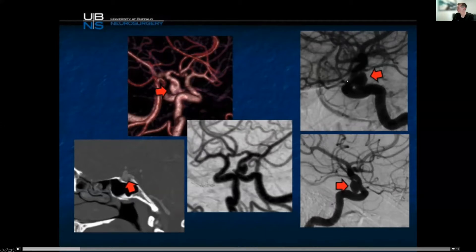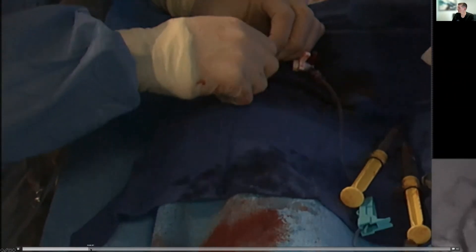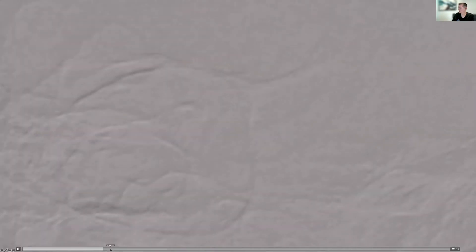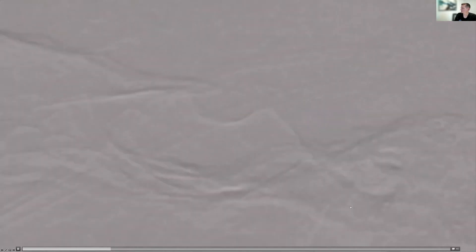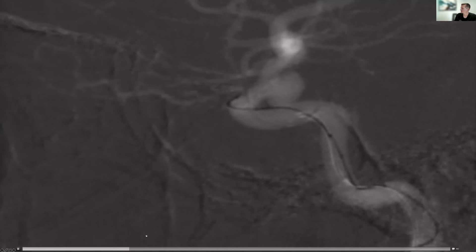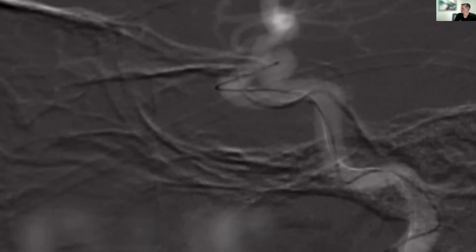It's probably not even cavernous. You can see the ophthalmic — that's our marker. We're going to go in with our biaxial system: guide catheter, microcatheter, synchro two wire. You can see our microcatheter right at the tip at the posterior genu. Under roadmap guidance we're going to cannulate the aneurysm, come around that anterior bend of the cavernous at the ophthalmic, and go straight into the aneurysm from there.